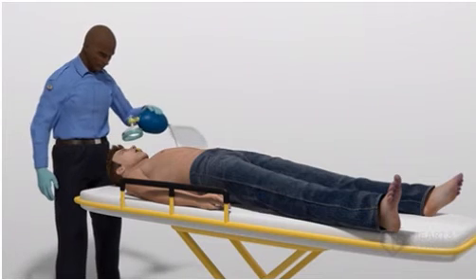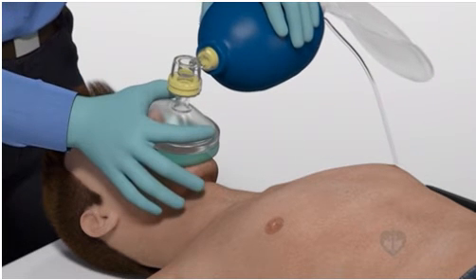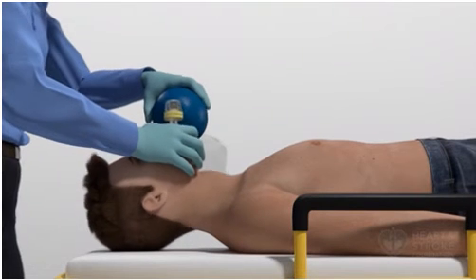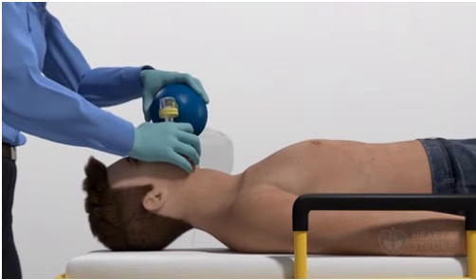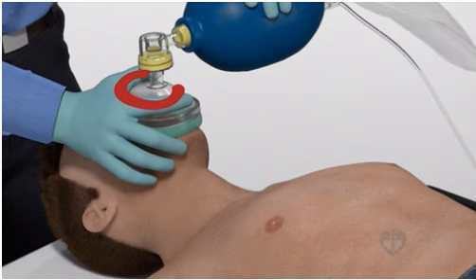Now, let's see how to properly use a bag mask device. First, position yourself directly at the top of the patient's head. Place the mask over the patient's face. Before providing bag mask ventilation, the provider must first perform a head tilt and then press the mask against the face while lifting the jaw into the mask. This is best achieved by forming a C with the index finger and thumb of one hand on the top side of the mask at the bridge of the nose. This motion firmly secures the mask to the face.